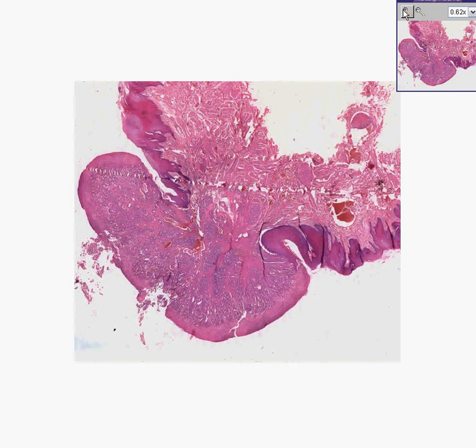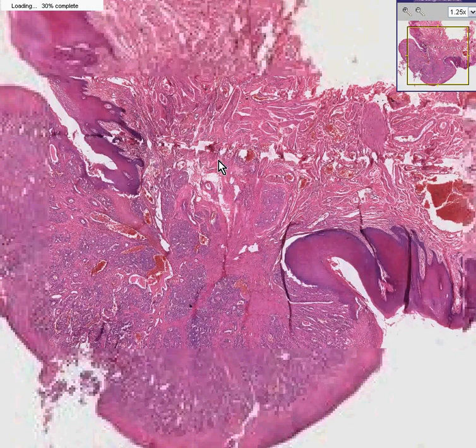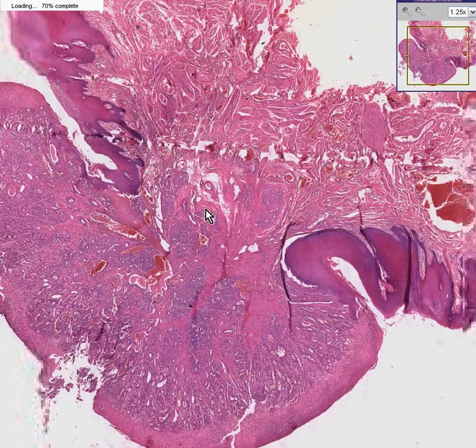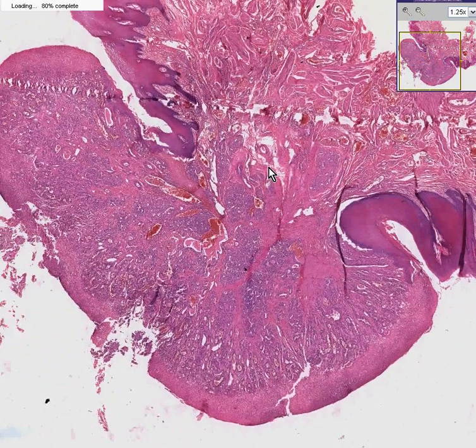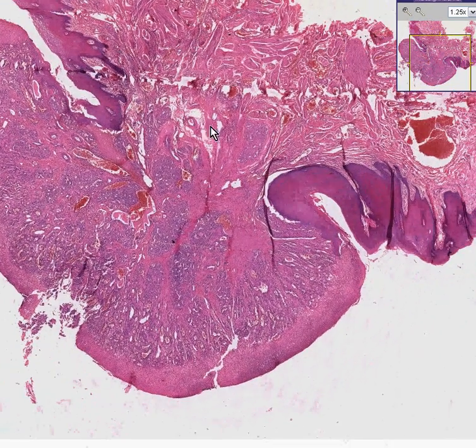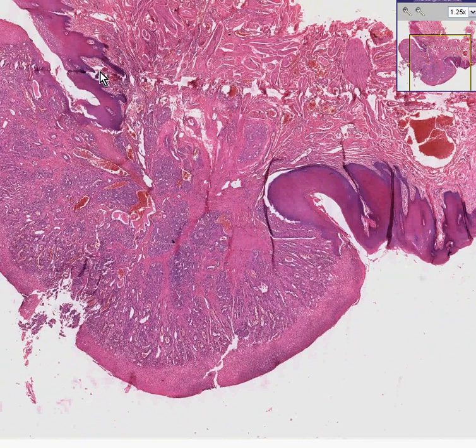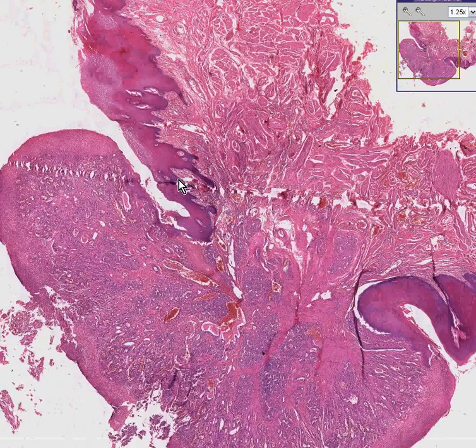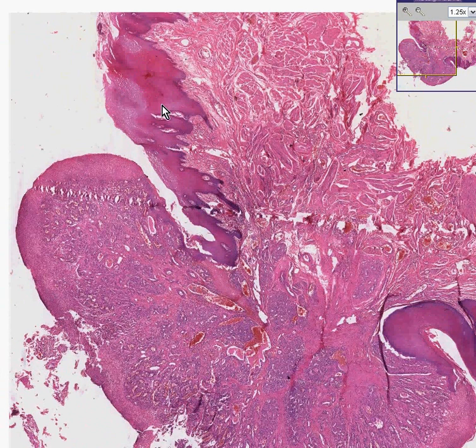Here is another case, and you'll be very happy to learn that it has nothing to do with lymph nodes or lymphomas, but you could already see that for yourself. What you see here is a squamous mucosa in which there is no significant keratinization and no skin appendages, so you know this has to be a non-keratinized stratified squamous mucosa.